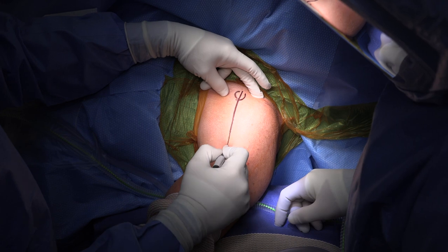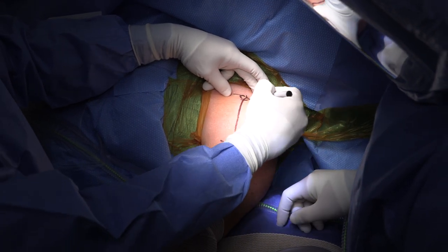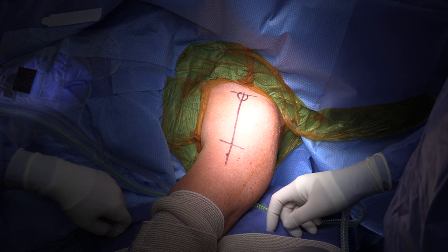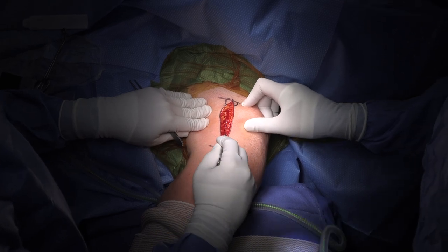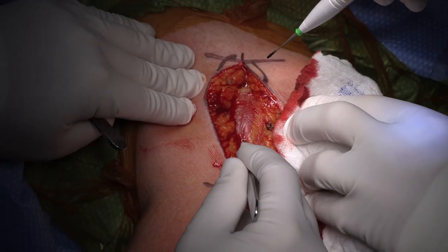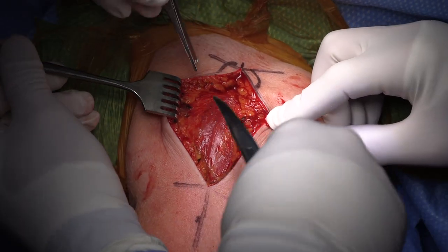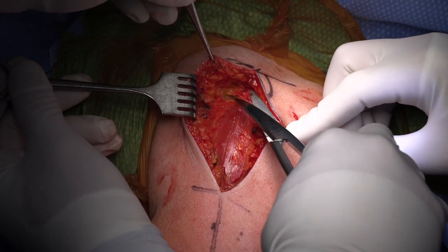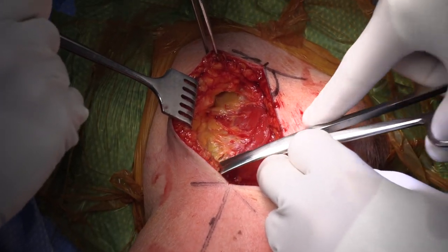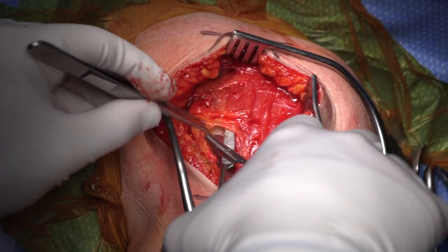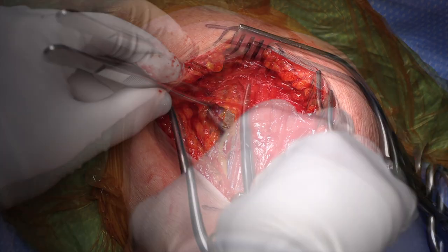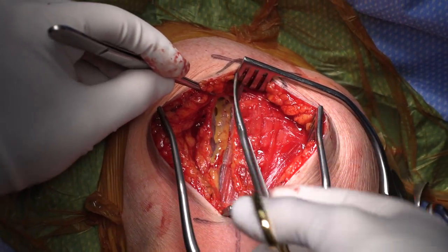This is a view of the left shoulder, with lateral on the right of the screen and superior at the top. The coracoid process is marked as well as the deltoid insertion. Using an anterior deltopectoral incision, the skin and subcutaneous tissues are divided. Medial flaps are developed to expose the cephalic vein, which is enveloped within a fatty tissue stripe. The coracoid process is palpated in the left superior corner, and the interval is developed proximally and distally with the cephalic vein retracted laterally with the deltoid.